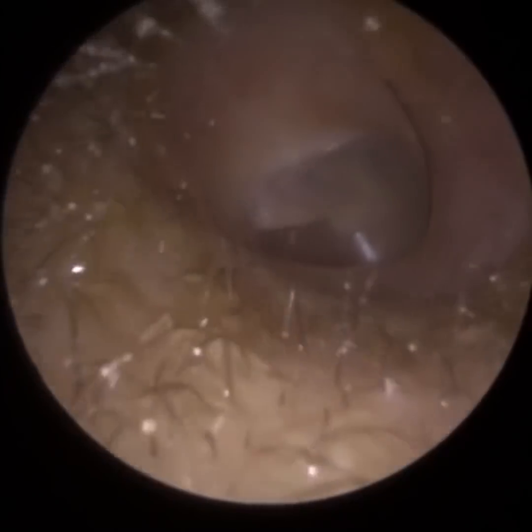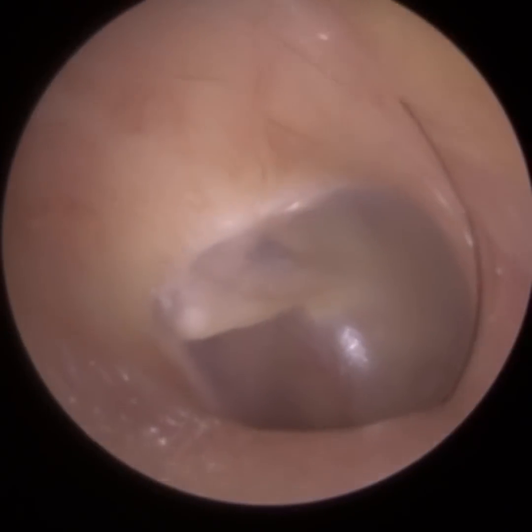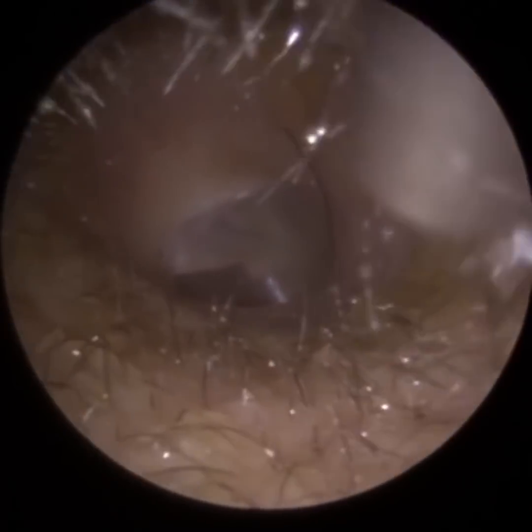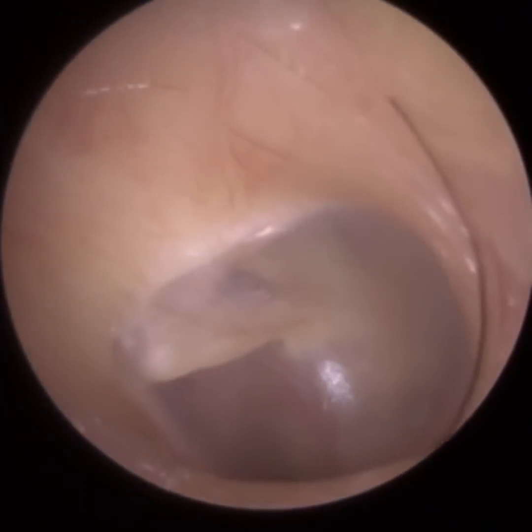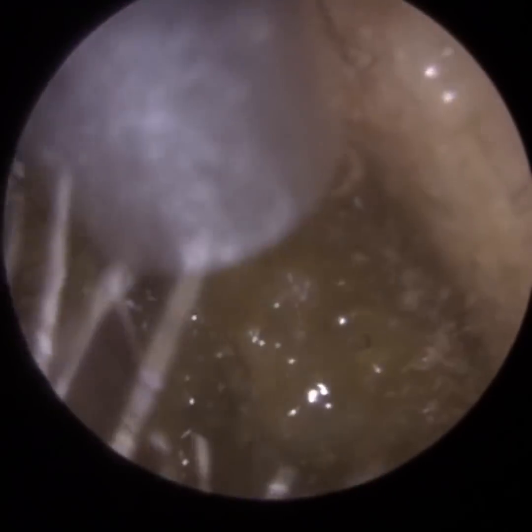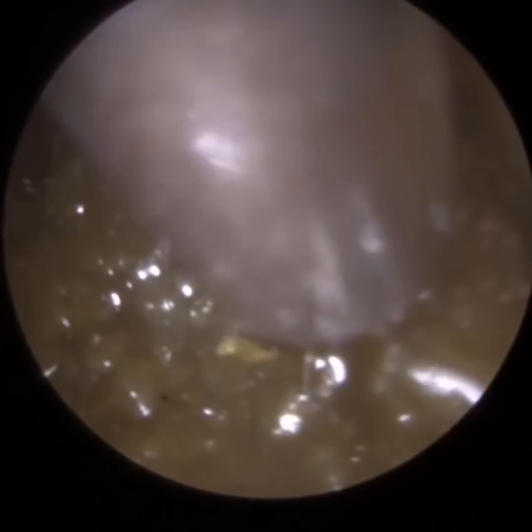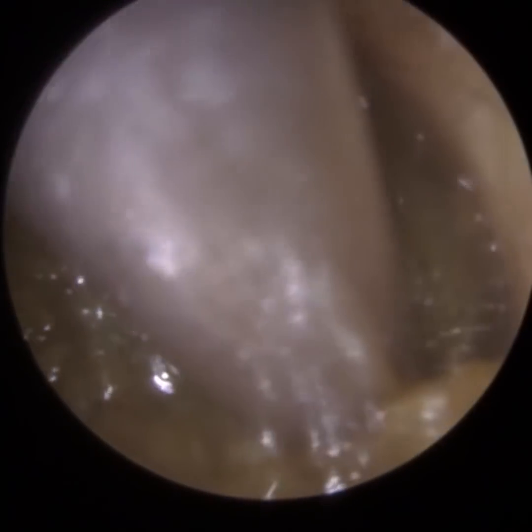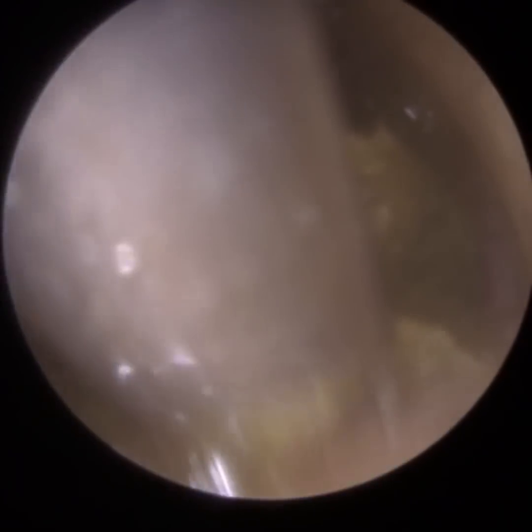There's a big plug that was there. Nice, healthy. You can just see how much cleaner it is. Yes, there's a strand of hair. We're not going to remove that, because trying to do that is going to cause trauma to the ear canal. Sometimes with those hairs, there's a bit that I can latch onto. That one was stuck to the drum and to the canal. The patient didn't know it was there. It doesn't cause them any symptoms.